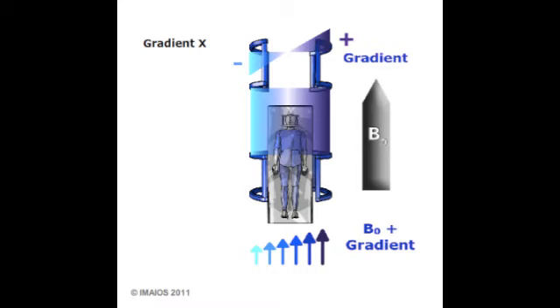So I can separate the spins of the protons on my left fingertips from those on my right fingertips. Left to right are sagittal slices. So if the X gradient is used as your slice selection gradient, you are creating sagittal slices. X gradient, sagittal slices.